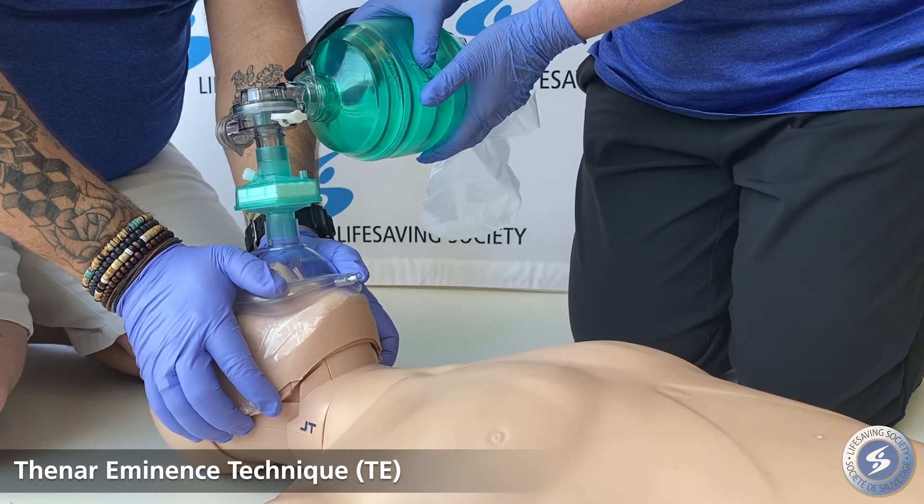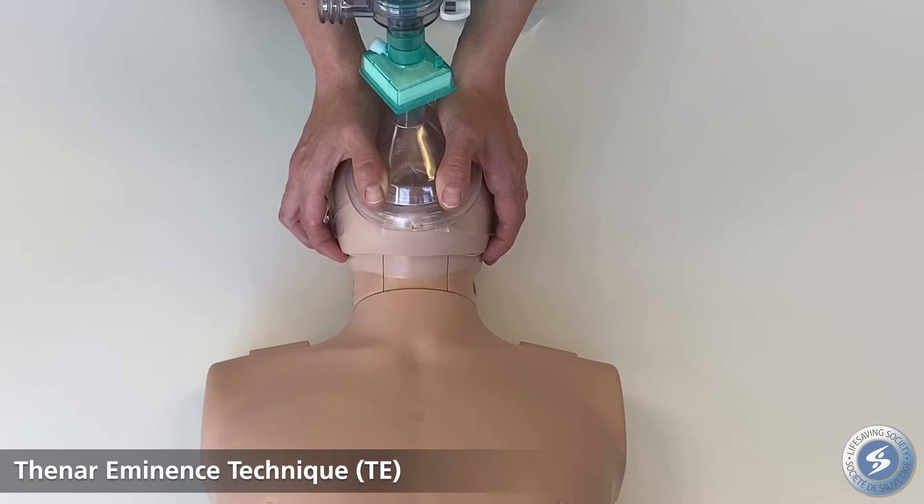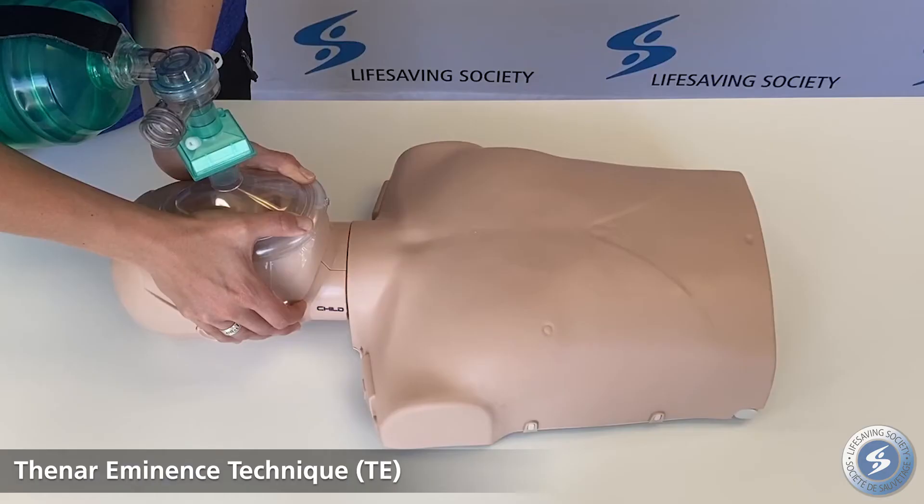Thenar eminence technique: with thumbs pointed towards the victim's jaw, use the heel of the hand and thumbs to seal the mask over the victim's mouth and nose. The four remaining fingers are used to lift the jaw and open the airway.